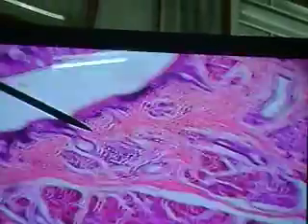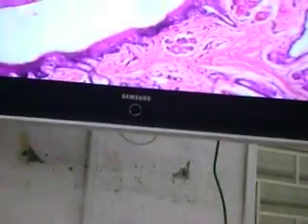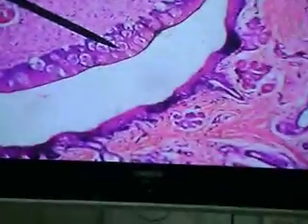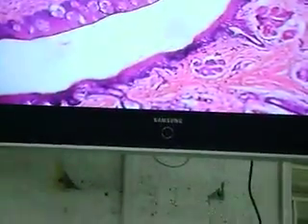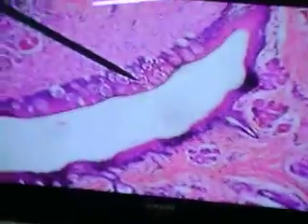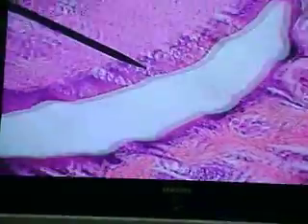And these are the ducts that are going to discharge the secretion of these seromucous glands into the vallus. And juxtaposed to where these ducts are, on the papillae itself, will be the numerous taste buds, so that we can appreciate the different tastes that are entering the mouth. Once you're eating, stimulating the superior salivary nucleus, inferior salivary nucleus, etc., you're now going to cause the glands to start to secrete a lot, and these secretions are going to be entering into the vallus and constantly washing out the vallus, so that we can be continually appreciating the new taste that the taste buds are exposed to.